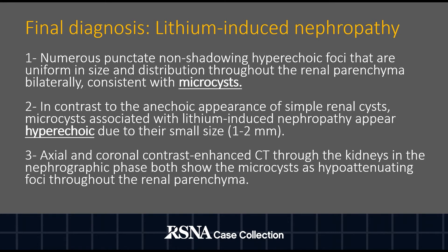In contrast to the anechoic appearance of simple renal cysts, the microcysts associated with lithium-induced nephropathy appear hyperechoic due to their small size of one to two millimeters. Axial and coronal contrast-enhanced CT through the kidneys in the nephrographic phase both show the microcysts as hypoattenuating foci throughout the renal parenchyma.